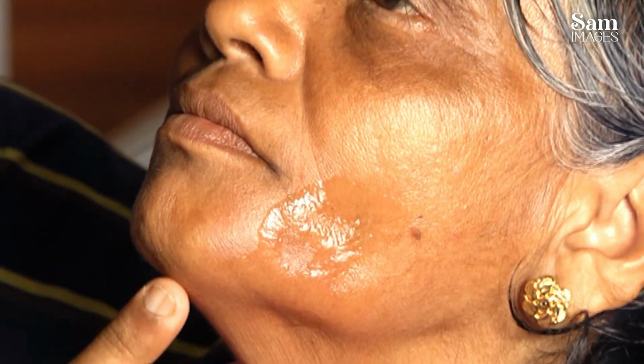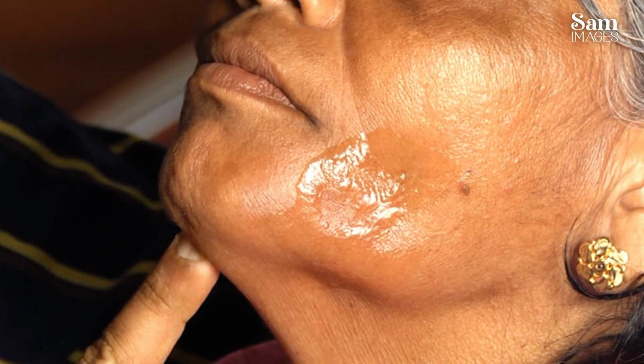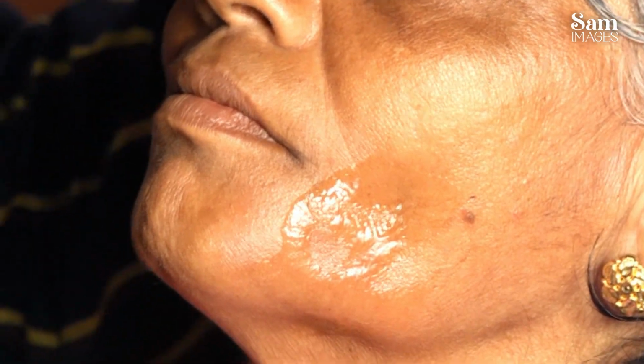See, this is the submental, okay, and this is the submandibular, okay.